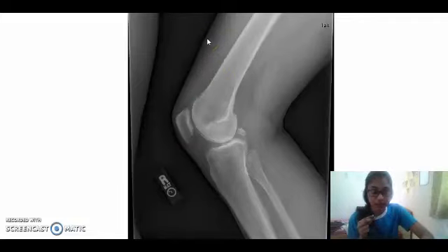adequate because the bony trabecular pattern and cortical outlines are visible, and the soft tissue are also visible, indicating the mAs used is adequate. The normal mAs and kVp used for this projection is 65 kVp and 7 mAs, and the film used is lengthwise, and there is no patient ID or patient name. So in conclusion, I will reject this film because there is no patient ID and patient name.